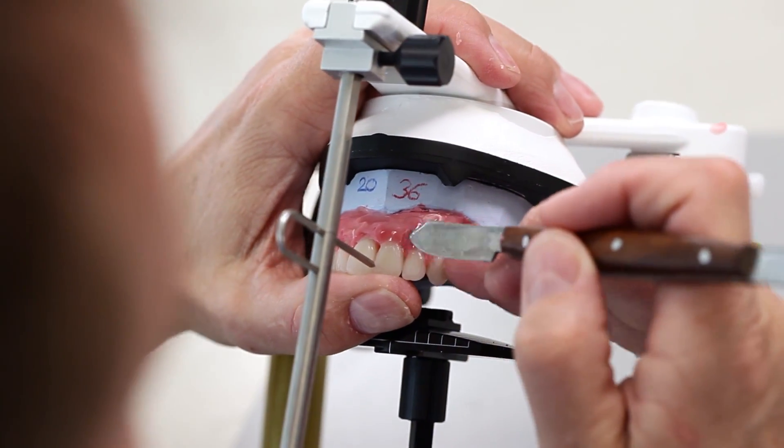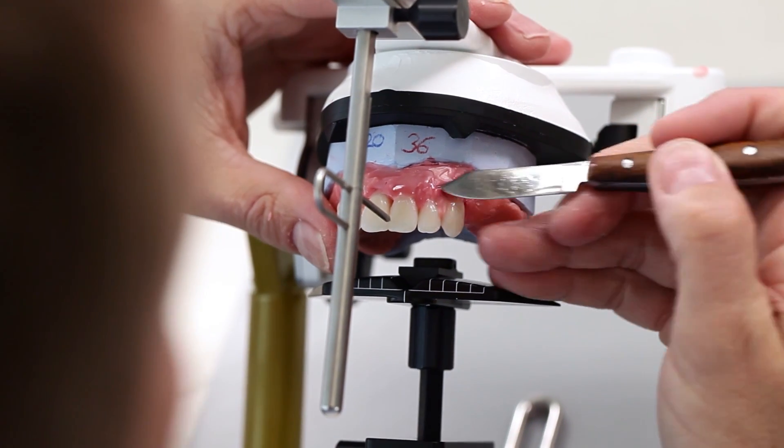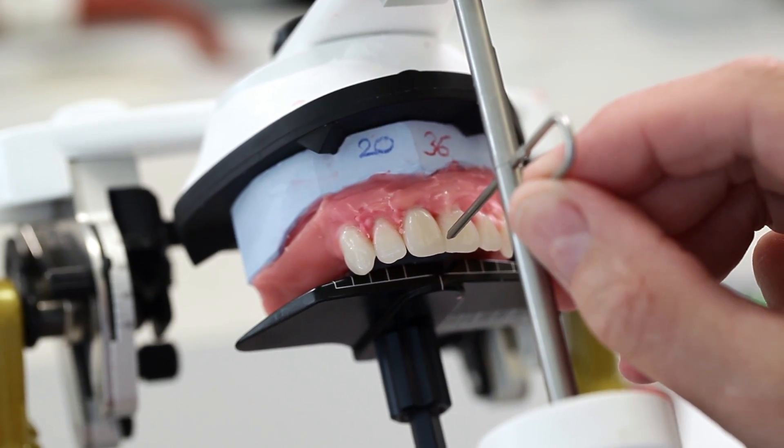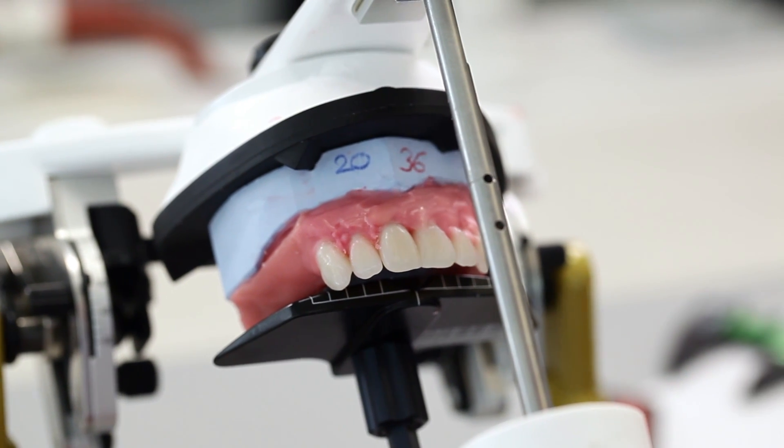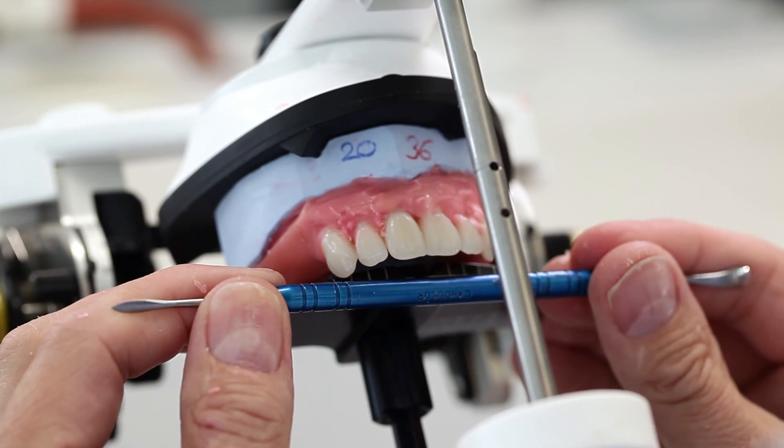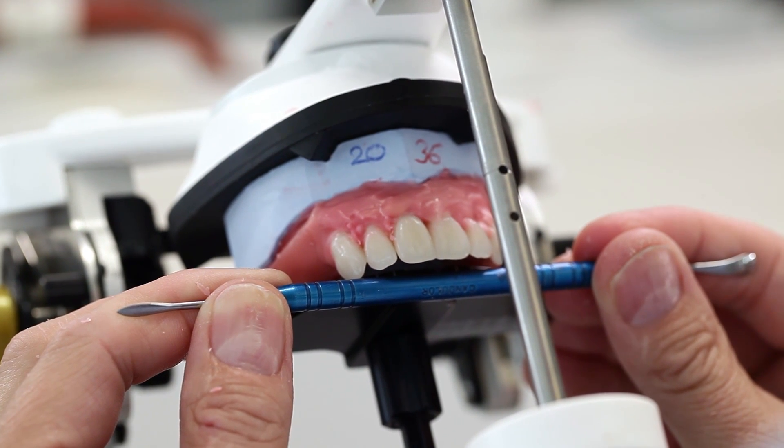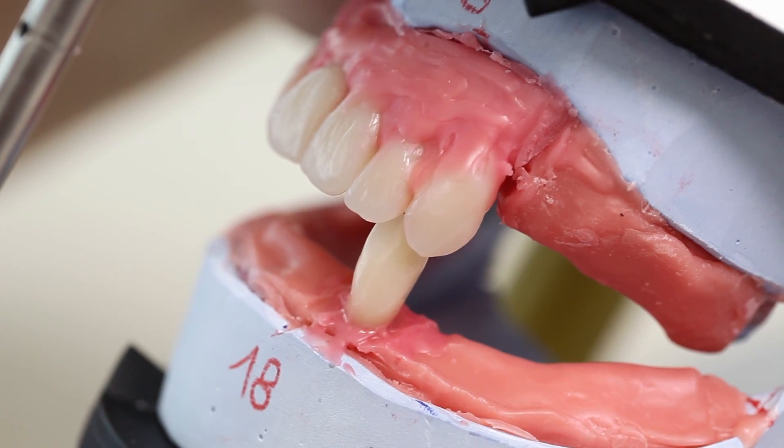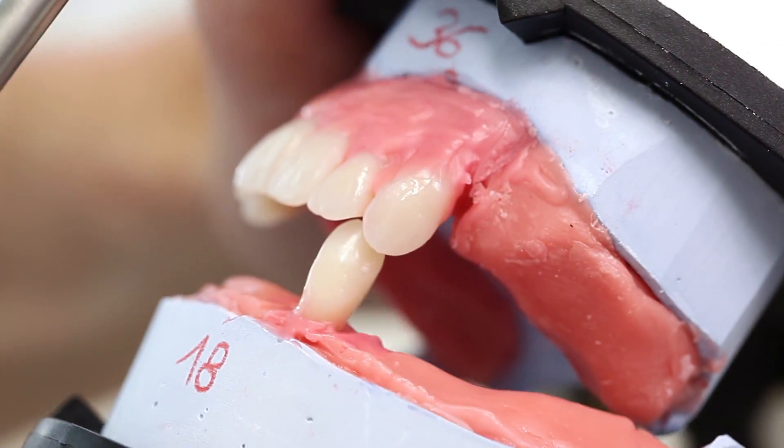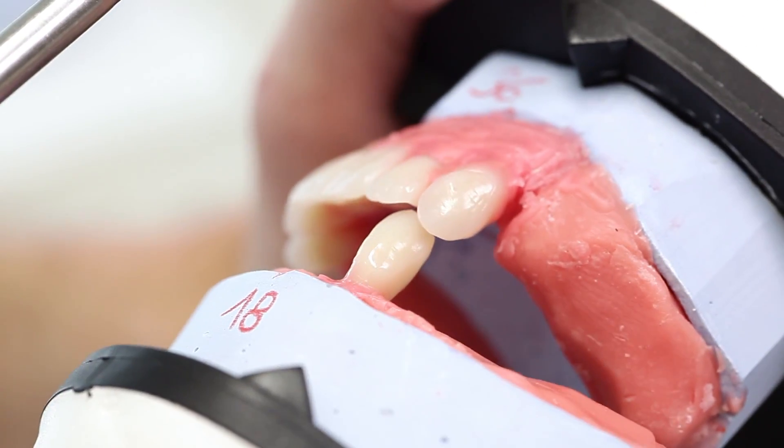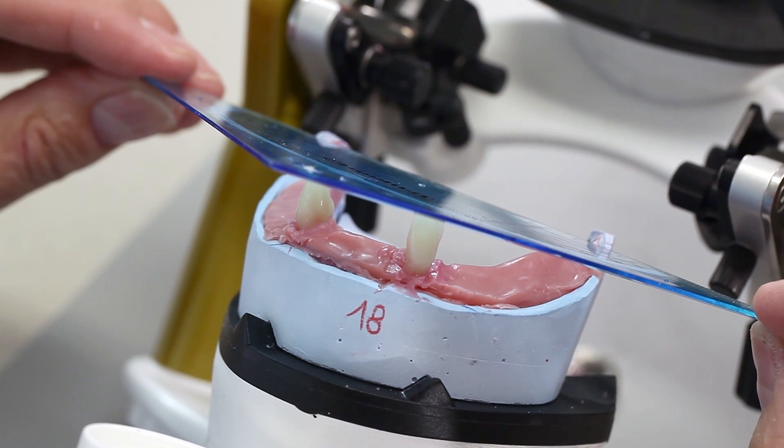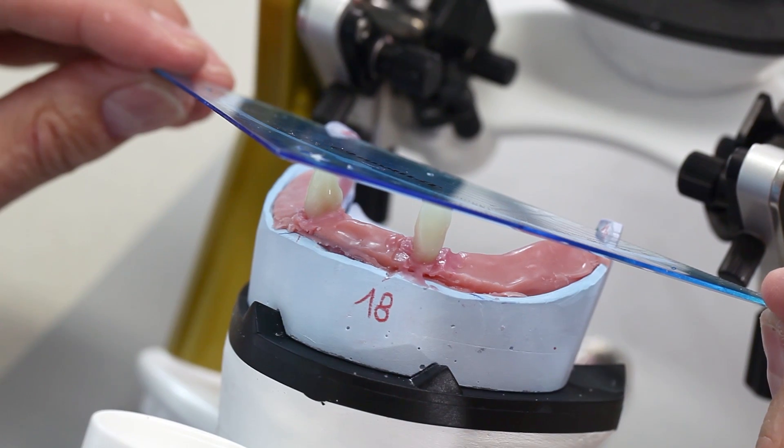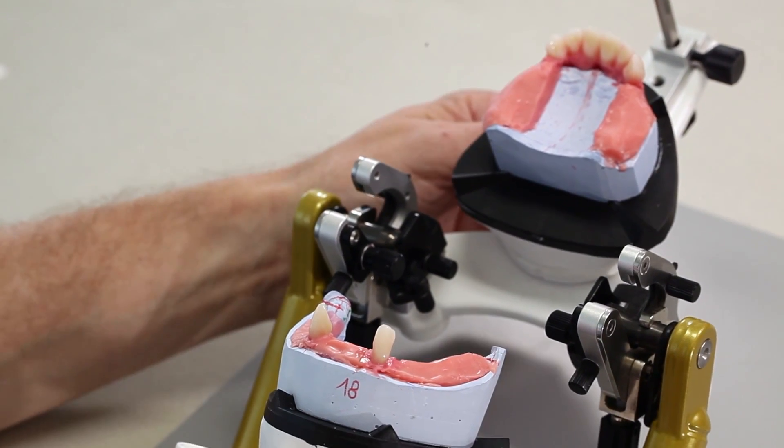The symmetrical line system of the template enables the verification of the harmonious position of the teeth. This lively setup supports the natural effect of the dental reconstruction. The extension of the longitudinal axis of the mandibular canine points between the maxillary lateral incisor and the canine. Basically, bilateral symmetry to the setting up template has to be kept in mind during the setup, in other words the average value orientation.